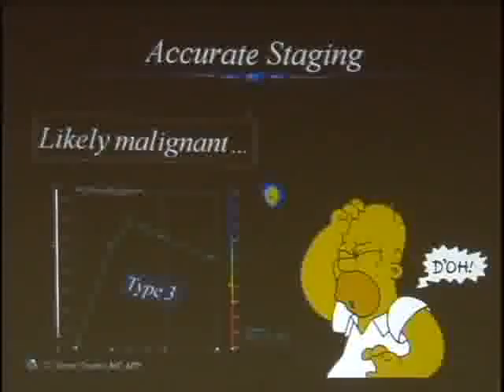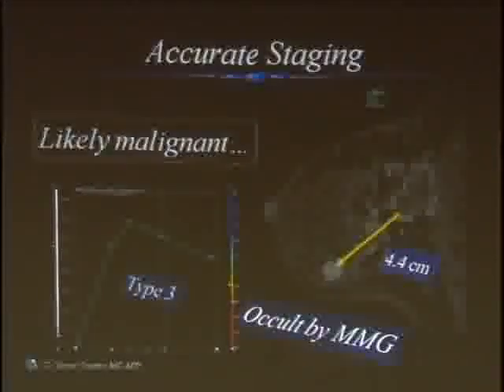here's the contrast study. There's something there in that same breast. Let's see what its perfusion pattern is. Type 3, that's highly likely to be malignant. Oh! Okay, now where is that in relation to where they were operating? Uh-oh. Okay, now this is good because now we know that's there. The therapy changes. Now instead of doing lumpectomy, this patient has to have a mastectomy.